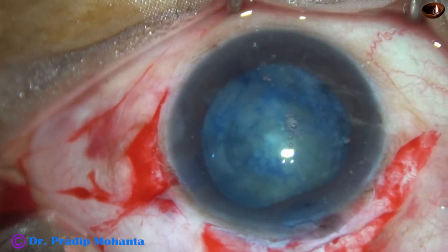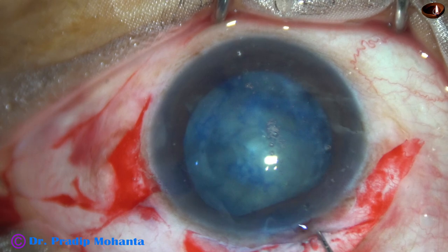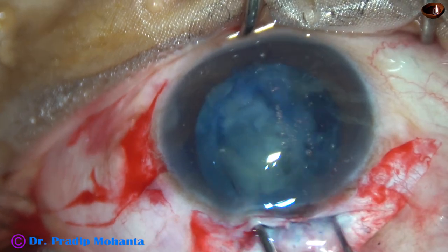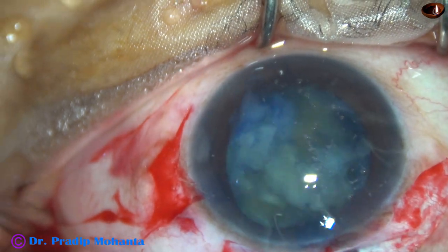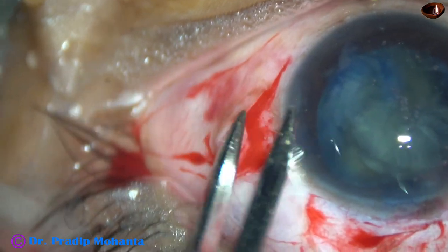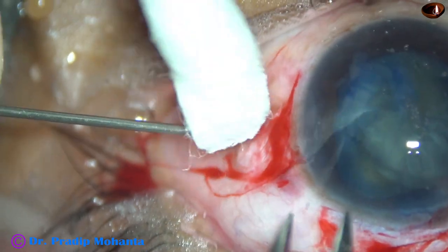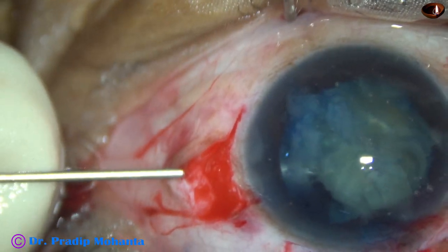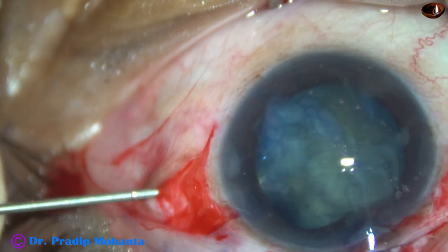I inject Viscoelastic. Now I take two hooks and try to hold the nucleus, but I could not hold it nicely. I found the nucleus in the anterior vitreous — it has not yet dropped. So I took a 24-gauge needle, pierced it through pars plana, 3 mm behind the limbus, went behind the nuclear mass and supported the nucleus.